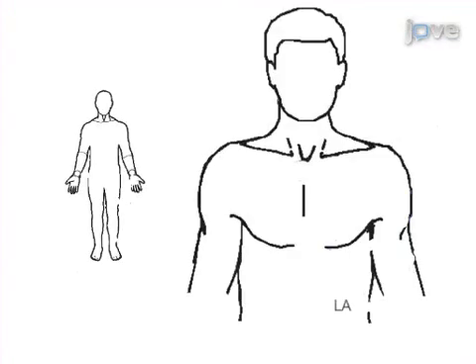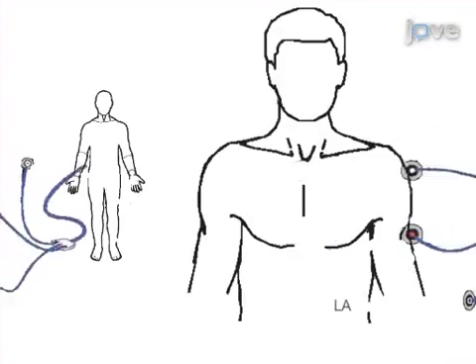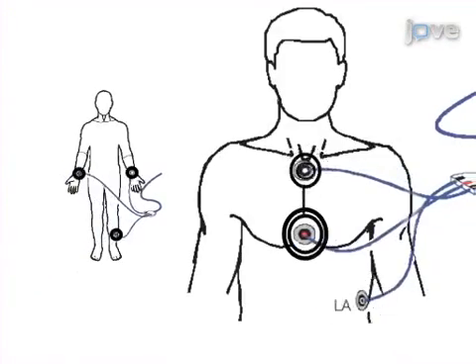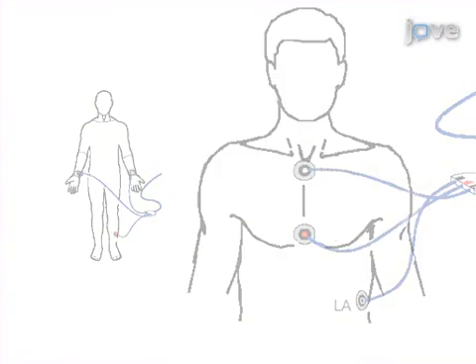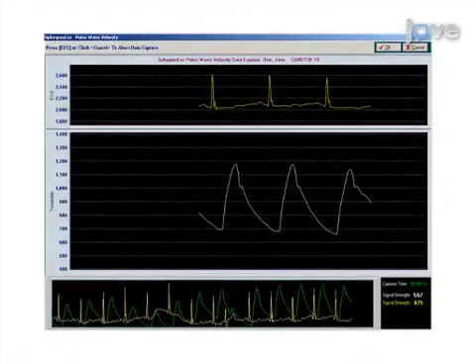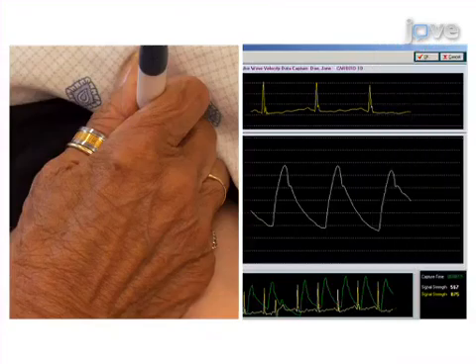In the second step, three ECG electrodes and leads are attached to the patient in a modified lead-two configuration. Next, carotid pulse waveforms and then femoral waveforms are acquired using a tonometer.